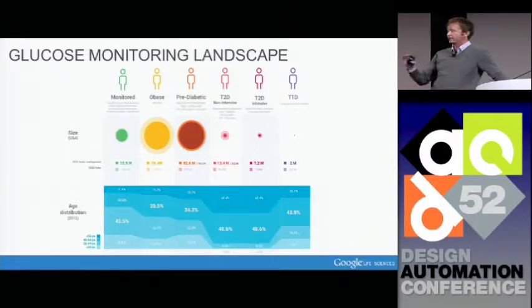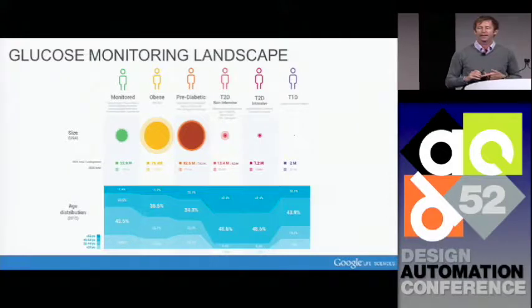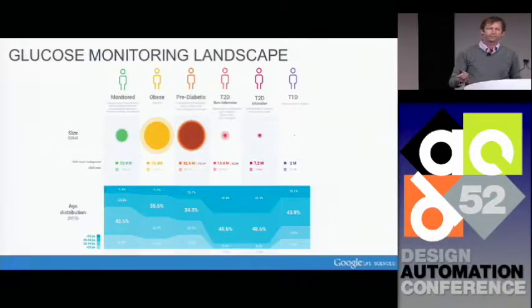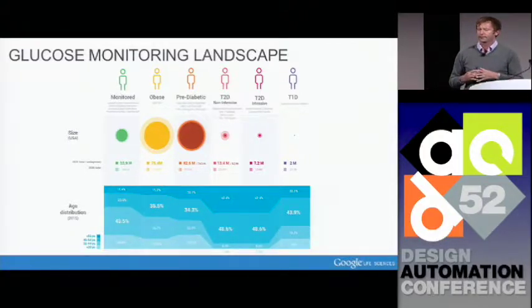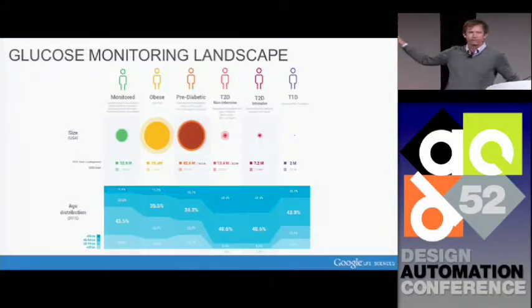There's a huge spectrum. Starting from type 1 diabetes, these people are born with the disease, their body produces little or no insulin at all, and they absolutely need to have access to accurate blood glucose information. That said, there's a relatively small number of people, a couple million people in the US. The second category is type 2 intensive, people with very extreme cases of type 2 diabetes that also need to dose insulin. And this is, again, a relatively small percentage, but the existing diabetes technology that is out there is typically targeted at these top two categories.